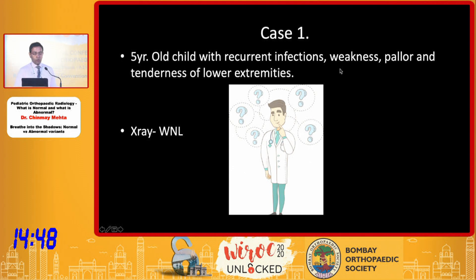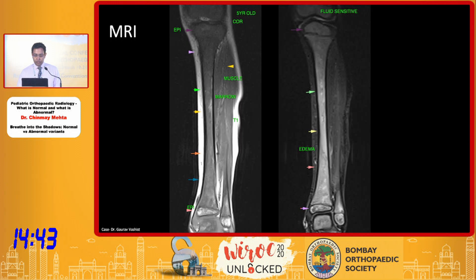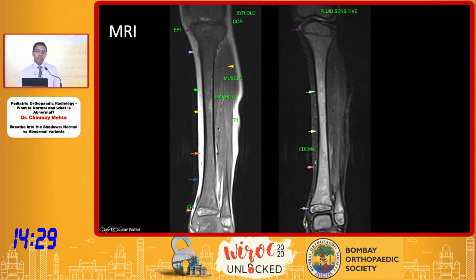Let's look at the first case. It's a five-year-old child with recurrent infections, weakness, pallor, and tenderness of the lower extremities. When you look at the T1 image of a five-year-old and compare it with this patient, we see that it is diffusely hypointense on T1 — it is darker than the muscle. So this is not red marrow; it is something that has replaced or infiltrated into the normal fatty marrow.